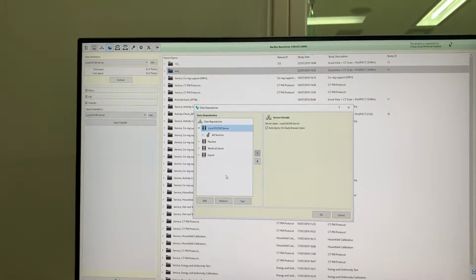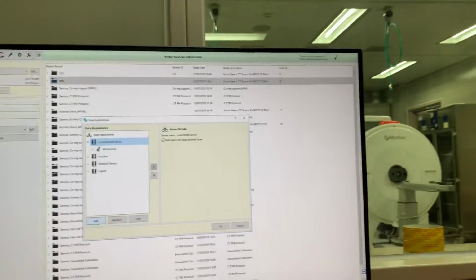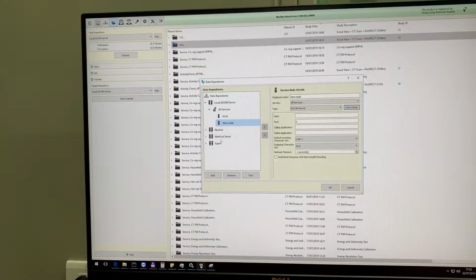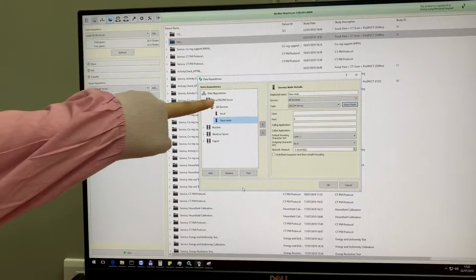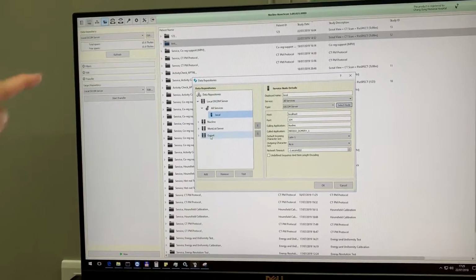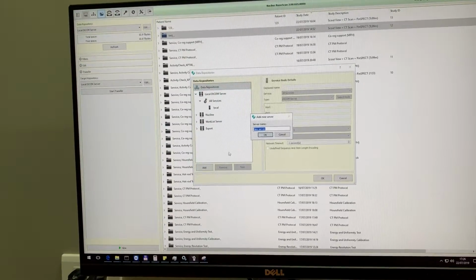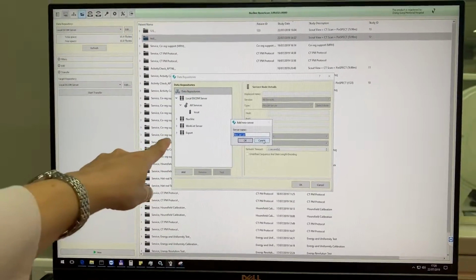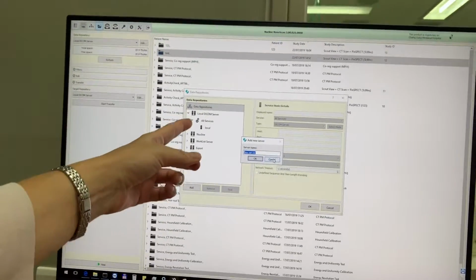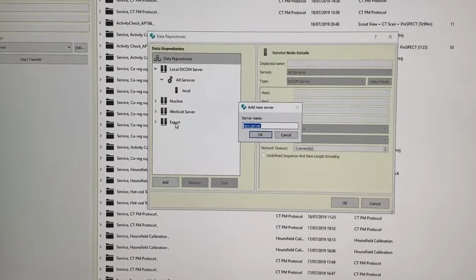Yeah. So we should like edit. Yeah, but let's try it because this is not really the way. No. Yeah, this is something which you must not do. Yeah. So first select the data repository. Yeah, and now click the add. Because it will create just a new line here. Because by default maybe the local DICOM server is selected, so it will create a new node, and it's not something we want. So can we use this export?